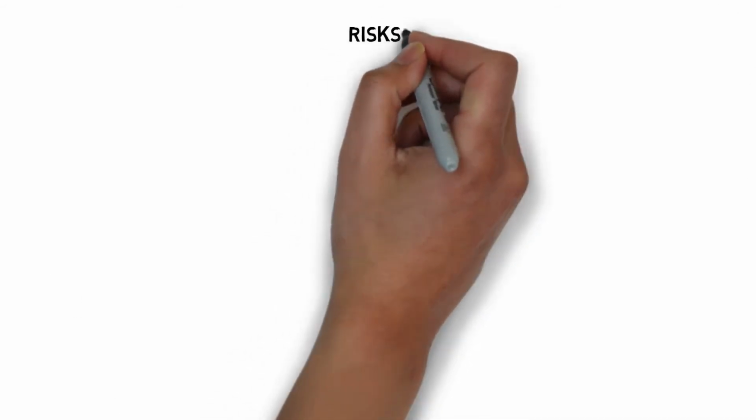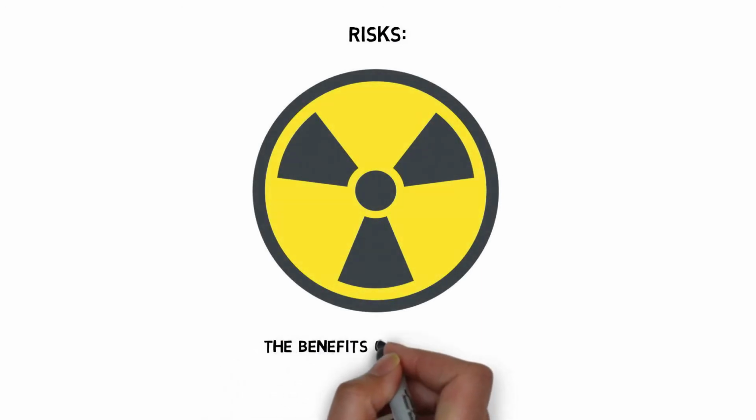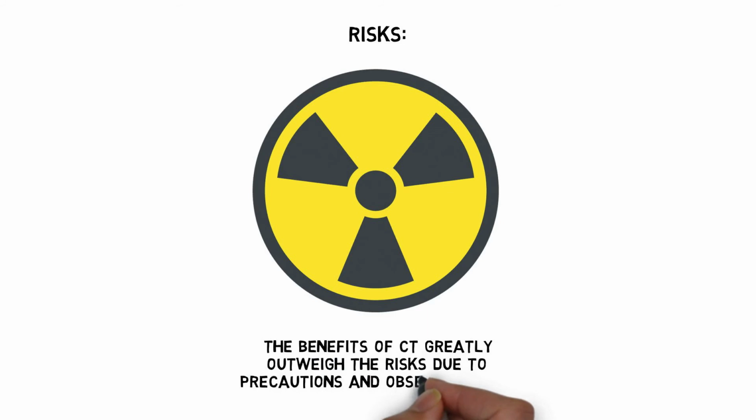CT scans, just like X-rays, have their risks as they use ionizing radiation. The rewards of diagnosing potentially life-threatening issues, however, greatly outweigh any potential issues with radiation, as precautions are always taken and limits are carefully observed. These risks are also addressed in the radiation video.